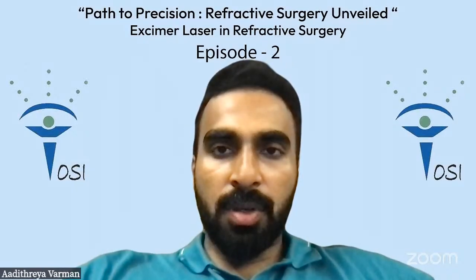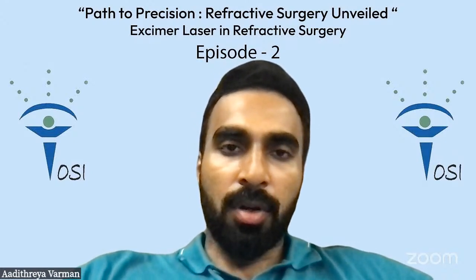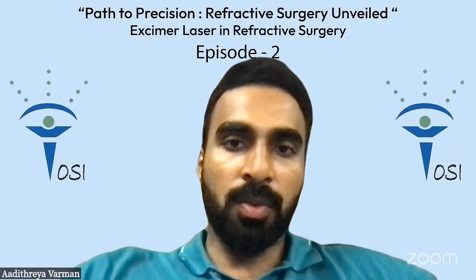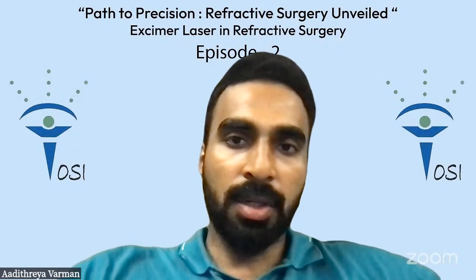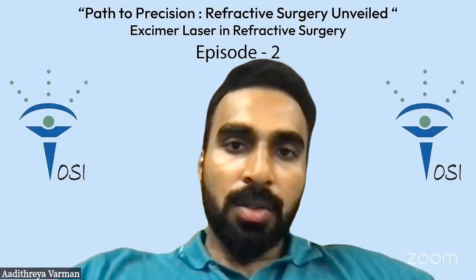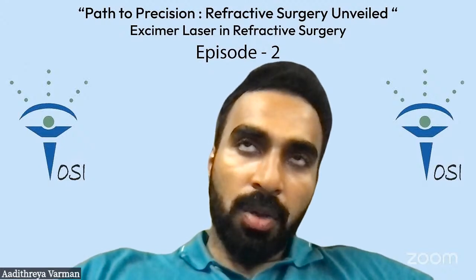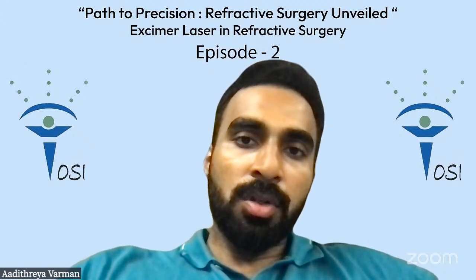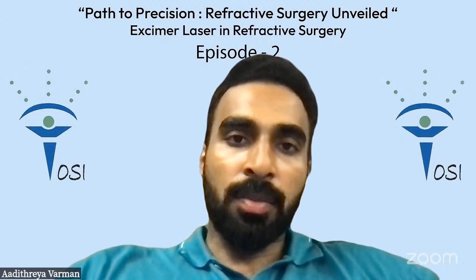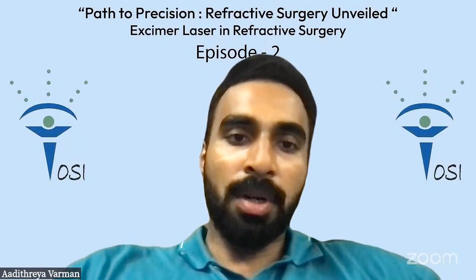So for Presbyon in specific, if a patient comes in the early 40s, we don't give the full minus 1.5, because they won't need the full minus 1.5 to see well at near, since they do have residual accommodation. For these patients, I'll target minus 1.25 or minus 1 also. With the minus 1, they're quite happy. They read quite well at N5. Before I do the procedure, I tell them that I'm giving you the near vision you need at this point of time. 3 to 5 years down the line, you will need touch-ups. I don't say you might, I say you will. You will need touch-ups to see a little better at near.